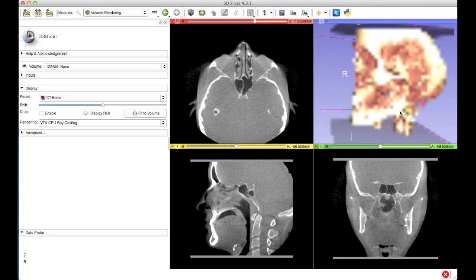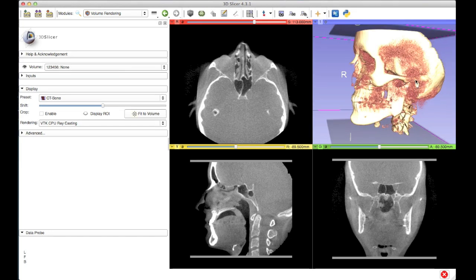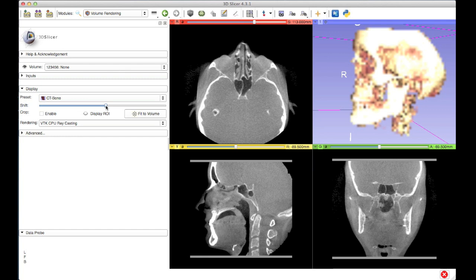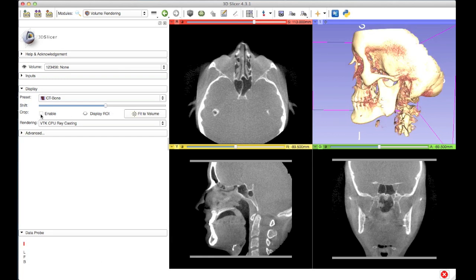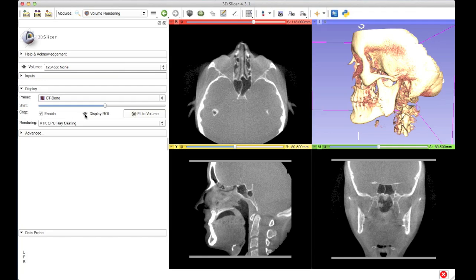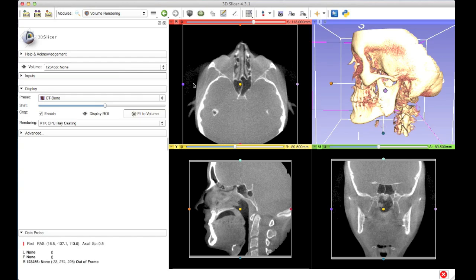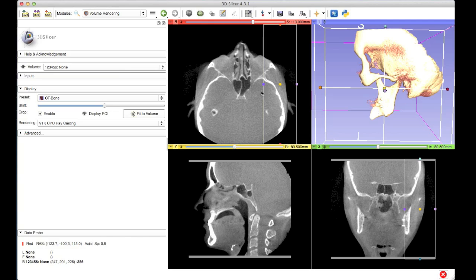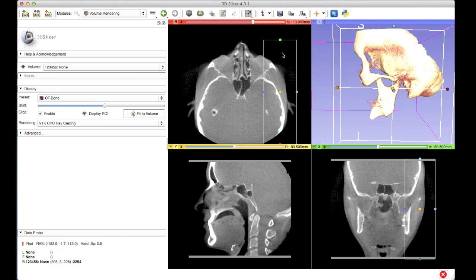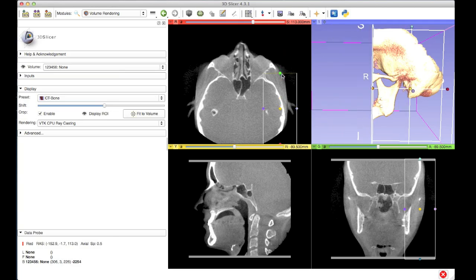I'm going to zoom in so you can see the TMJ. There's a little bit of an obstruction to my view, so I'm going to increase this threshold value such that only high intensity aspects of the data show through. And you can see now that the TMJ is really clear. So I can see my TMJ in the volume rendering, and this will be extremely valuable to me as I crop. Now I'm going to enable the cropping in the volume rendering module and display the region of interest — you can see right now that the whole volume is included in the ROI, but as I shrink that ROI the cropping is visible in the volume rendering in real time.